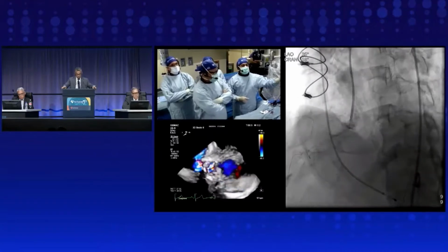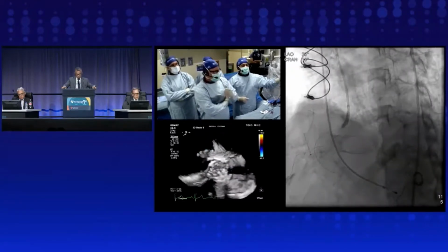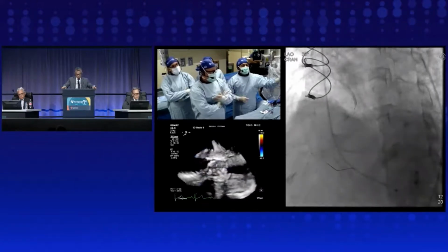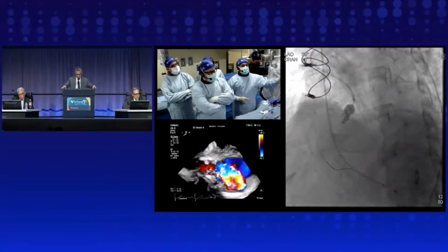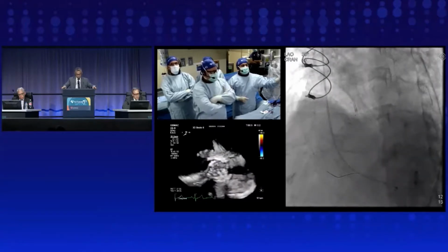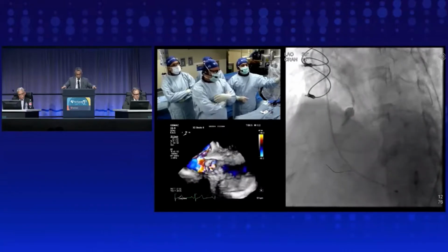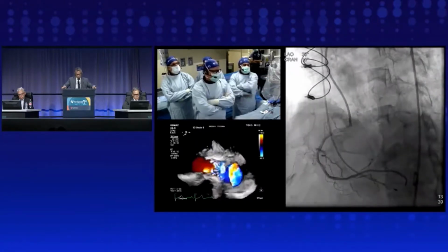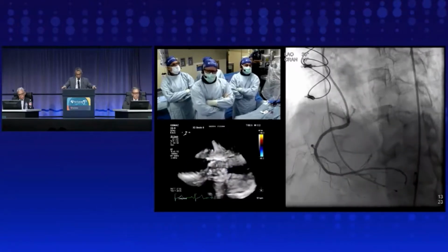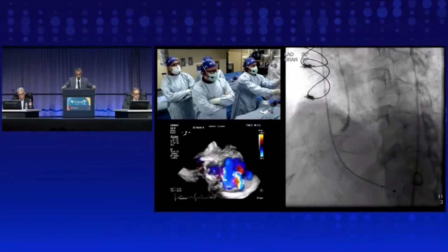Obviously, the big concern that Danny and I discussed was hanging a stent out into the aorta in a scenario where you're going to do a lot of catheter manipulation, and not wanting to have a dangling stent in the aorta engage with or interact with our catheter. So after cutting balloon and stenting, we used an Ostial Flash system, which is a nice balloon-in-balloon system.